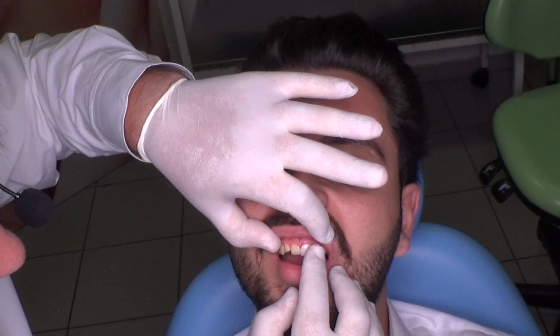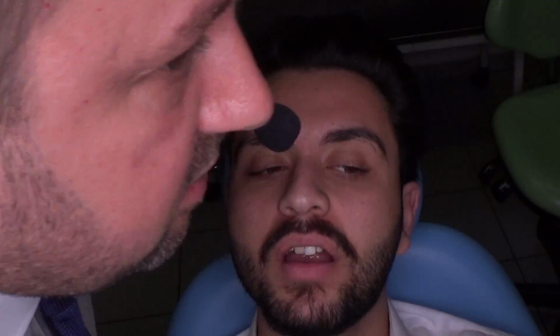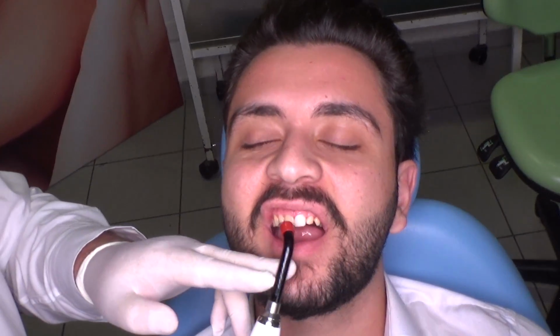As I told you, it should not be the best composite you can do. You just have to define the new position of the teeth. Take the light curing.